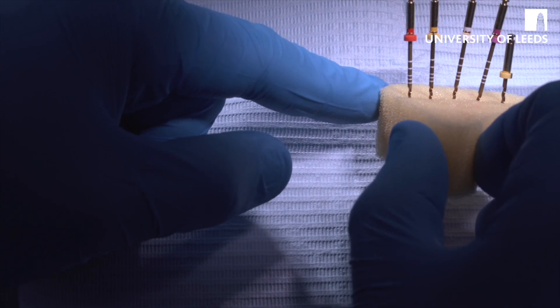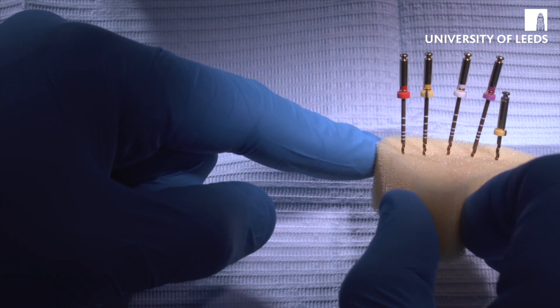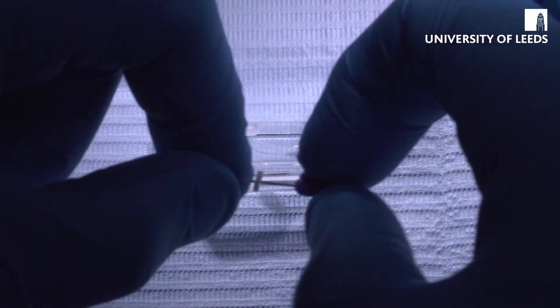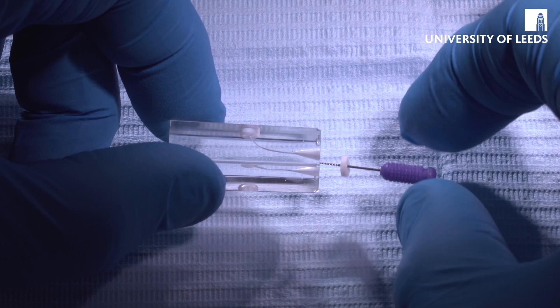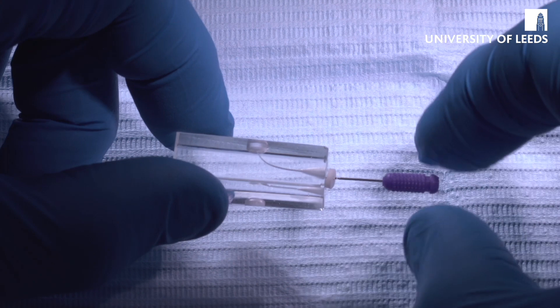These are all the files taken out of the packaging and put into an endo-view sponge, which is what I suggest you do. As with anything, we start off using hand instruments. First we have a size 10K flexo file, and this is just going to be used to scout the canal. We put it into the canal with passive engagement, just seeing how it feels.